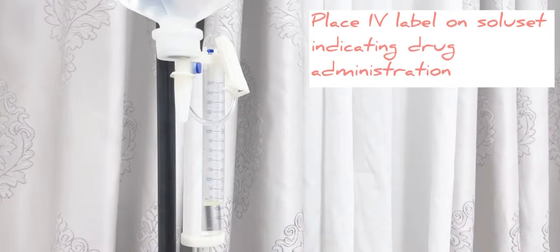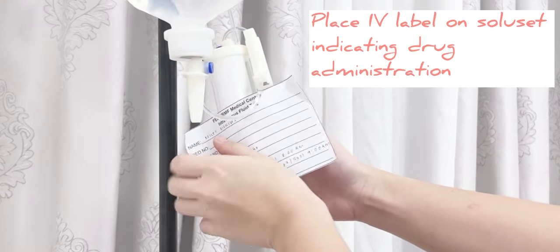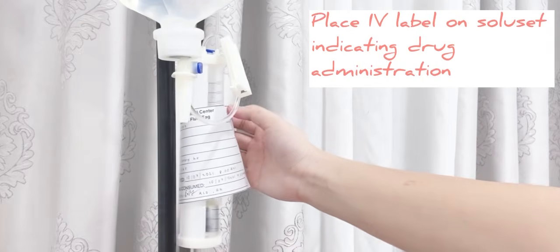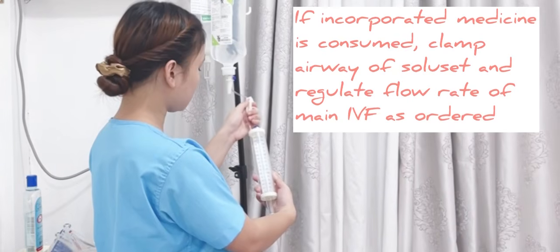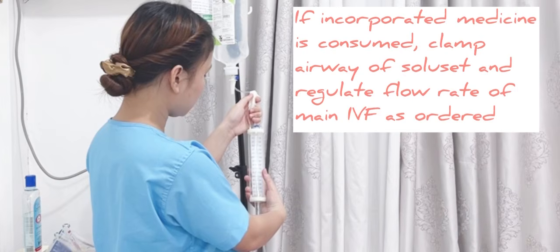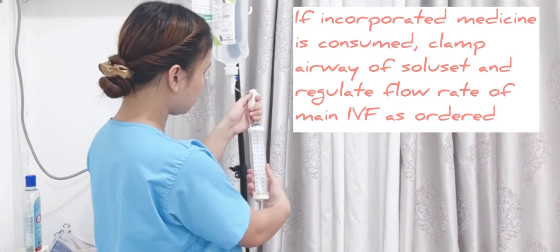Then place the IV label on the Soluset indicating drug administration as it can be easily read during infusion of solution and inform nurses and physicians of contents of bag and bottle. If incorporated medicine is consumed, clamp airway of Soluset and regulate flow rate of main IVF as ordered. Continuously infuses IV fluid after infusion of medication.